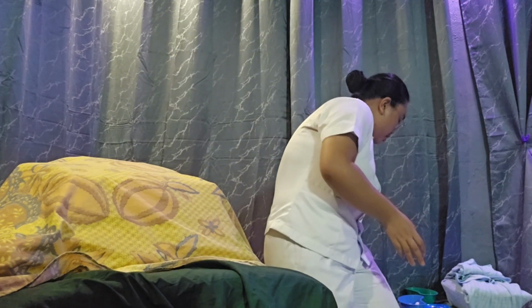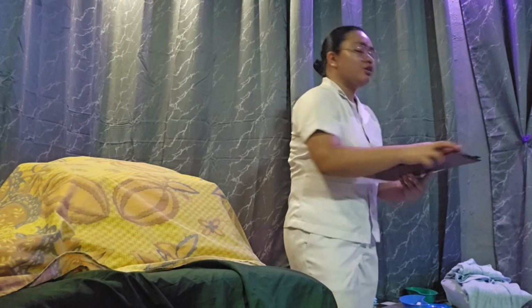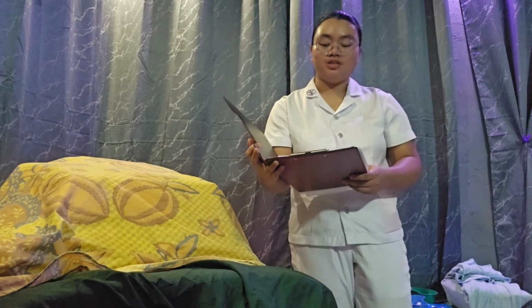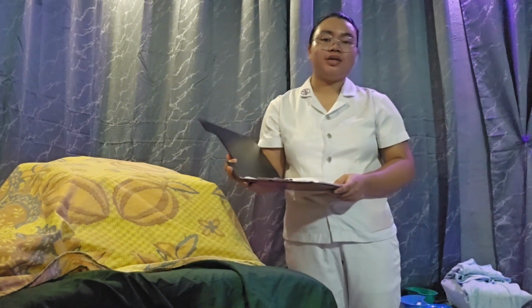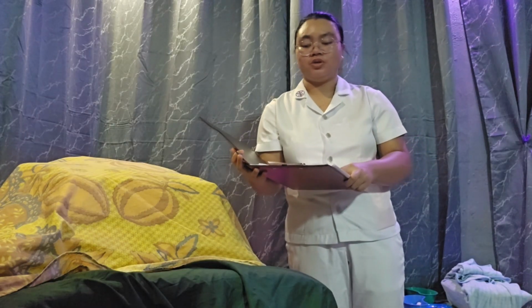So before anything else, we must first check the doctor's order to verify the necessity and the type of catheterization that we are about to do, and also to ensure that the procedure that we are going to do is safe and according to the physician's order.